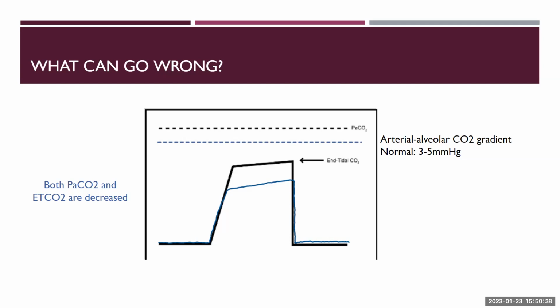If you don't have, absent the presence of anything that will basically block CO2 from going from one side to the other, then they should correlate very closely. And I think Mike had a good idea of that: if you breathe faster, then you blow off CO2 faster and it goes down, and then your EtCO2 might actually also show a lower gradient.